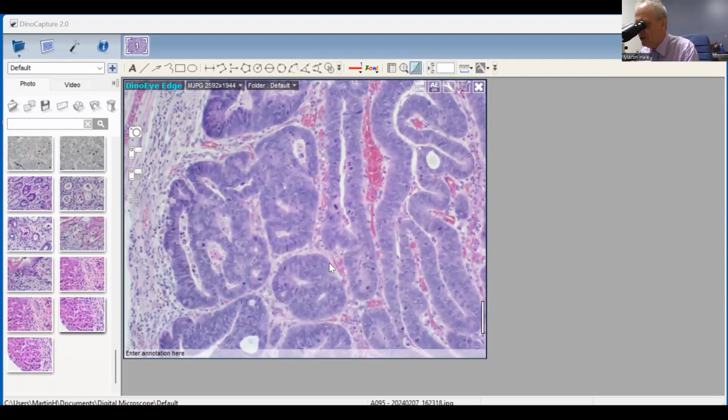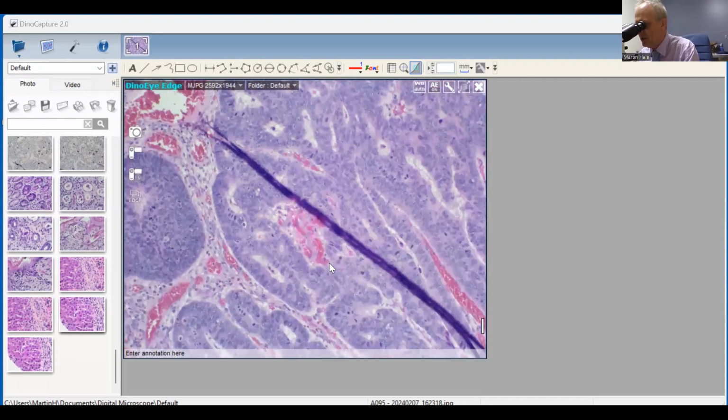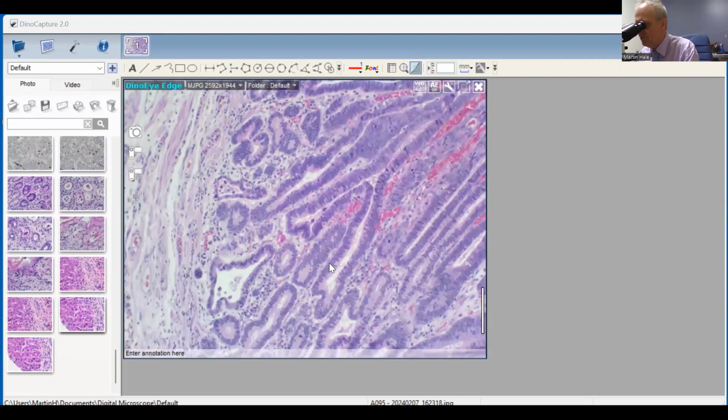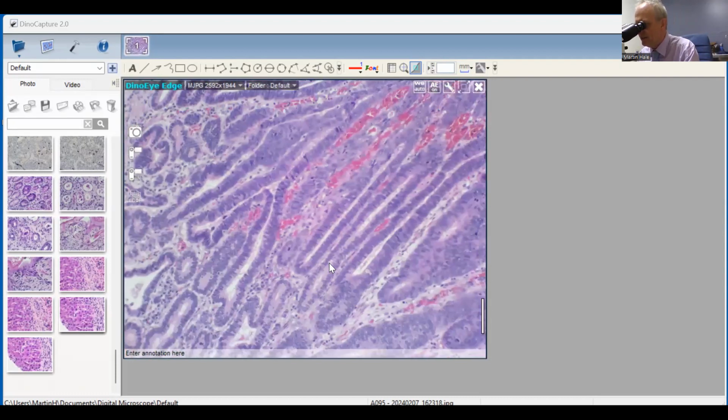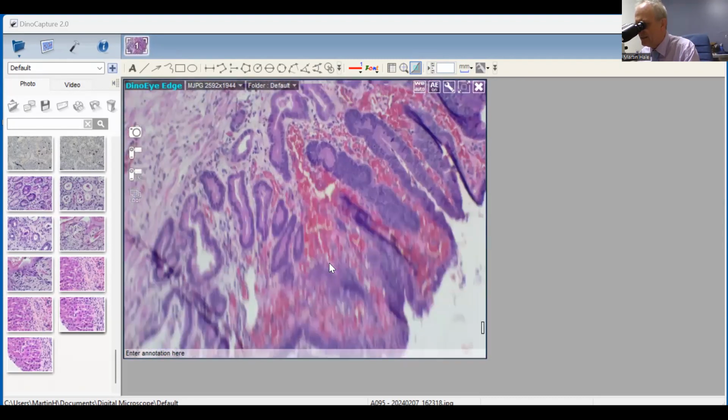But then when you search and you do levels, and that's where these levels that I was talking about come into play, because then you start to look for what you call infiltration. And this is the sort of thing that we look for.